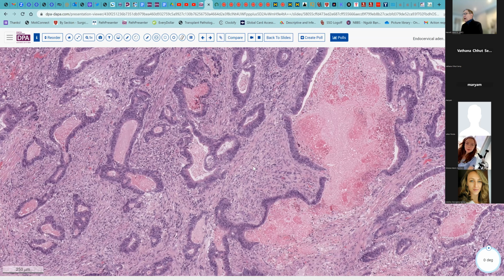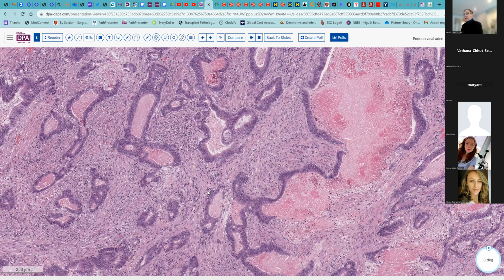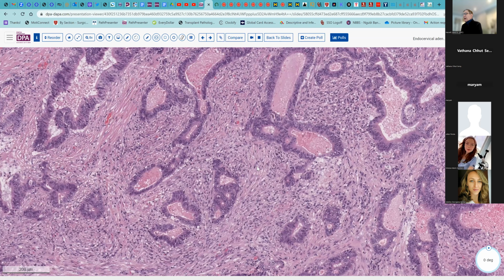And although this tumor had a bulky cervical mass, it was P16 negative. And so many initial observers might say, well, these look like very tall columnar type cells. They look more endometrioid in many respects, because this is more of an endometrioid pattern.